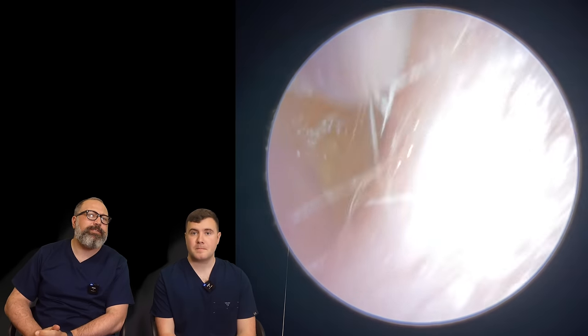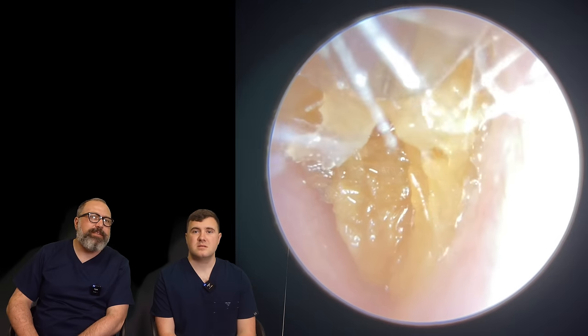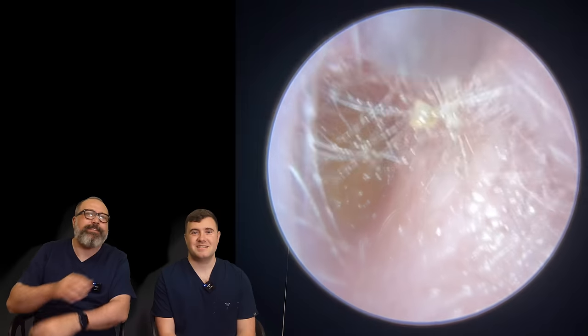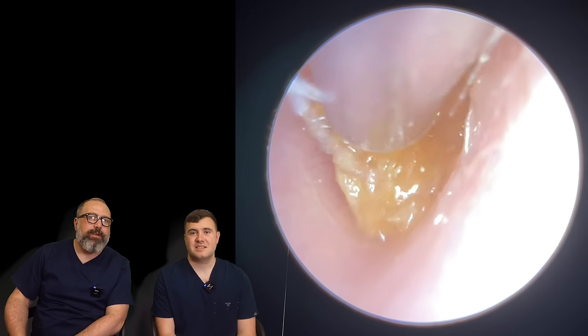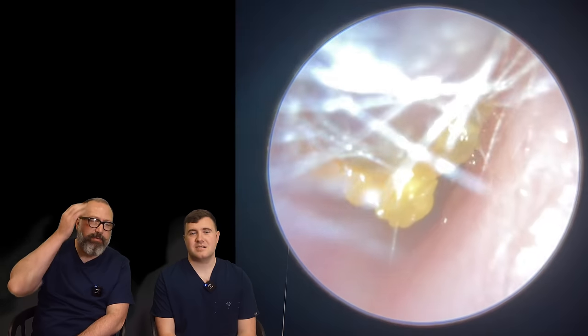So you can see, I think this patient's mine. You can see we've got a very, very sort of what appears to be skin. And that's exactly what's happened. As soon as you get that suction tube on, it all just collapsed into that suction tube. A little bit of wax in there as well, but this is coming away really nicely.